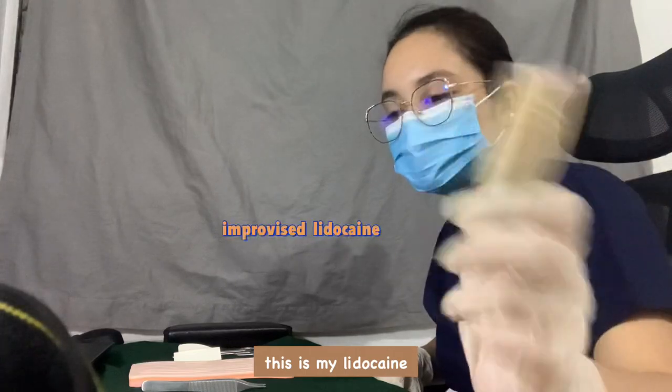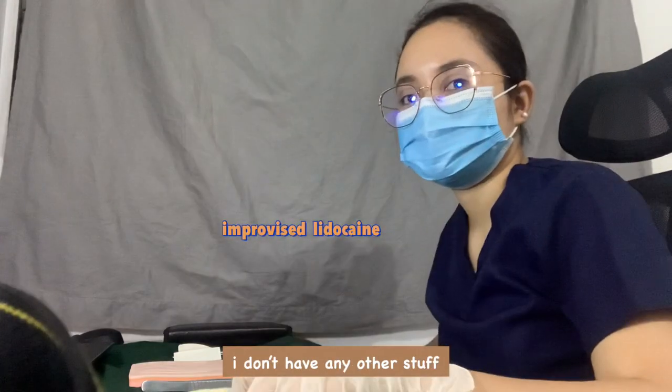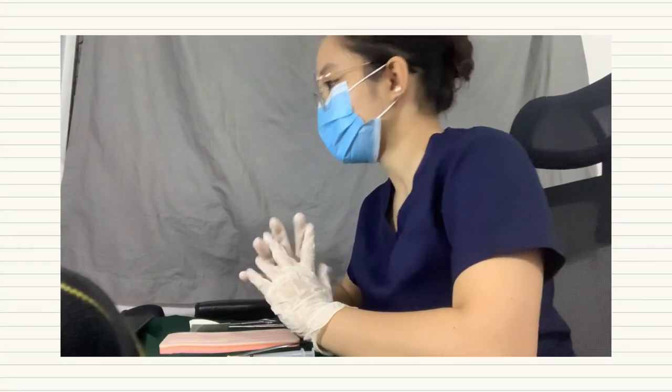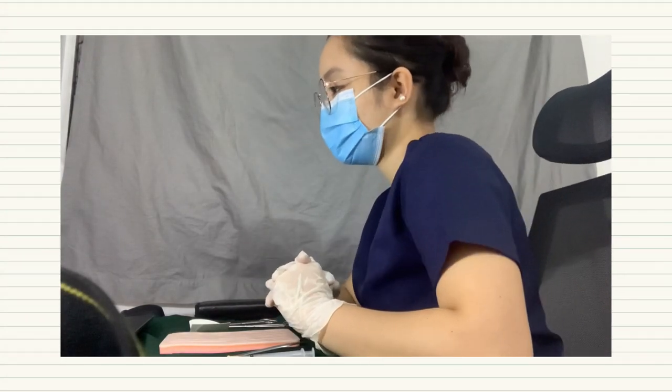It's my lidocaine. I don't have any other stuff. Well, I am junior clerk Justin Merronga. And today I'll be demonstrating the suturing technique.